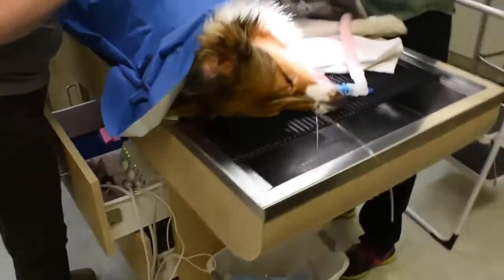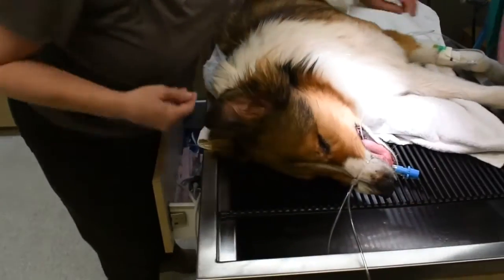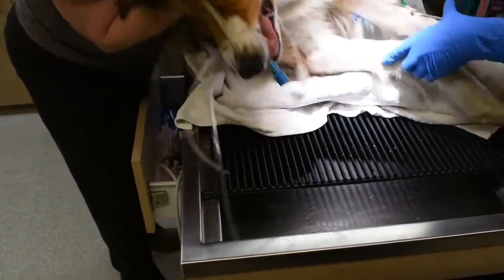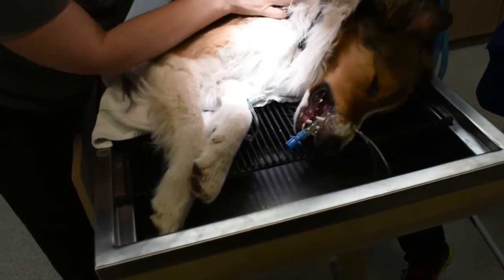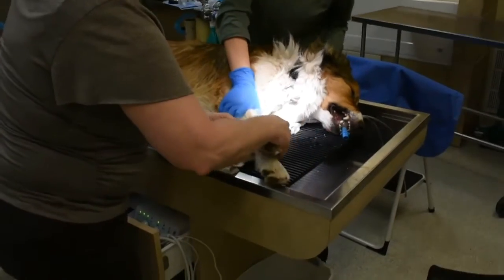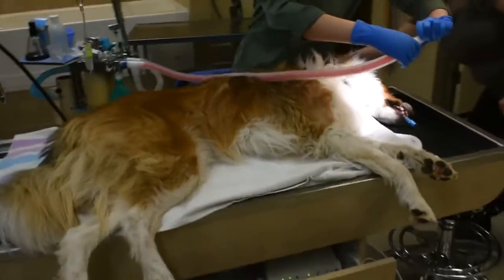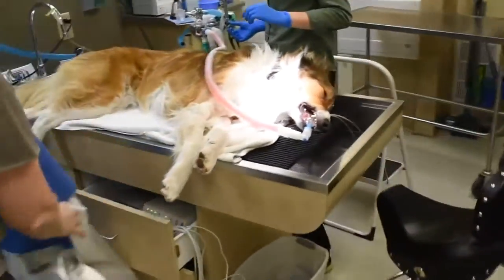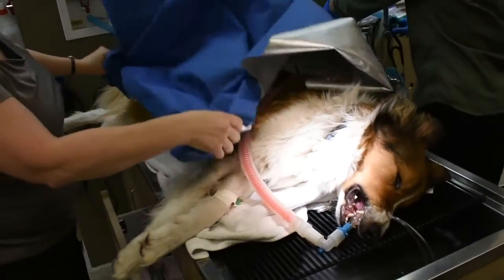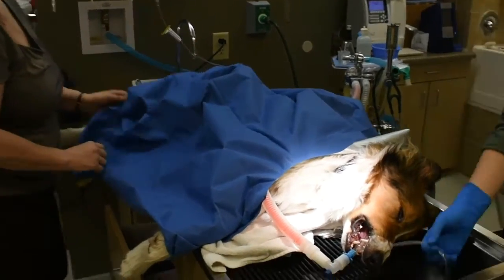Now that Todd's teeth have been cleaned and polished on the first side, it's time to flip him over so we can get at the second side. We always unhook our anesthesia patients from the anesthetic machine as we flip them over. The reason is we do not want to uncomfortably disturb the endotracheal tube that has been placed. We also make sure that when we are turning them over, it is from side to side with their head facing down and not over their back. The reason for this is if the dog or cat were to vomit and we did not know about it during the procedure, during this motion it would come out of the mouth versus going back down into their throat or trachea, causing further problems or issues.